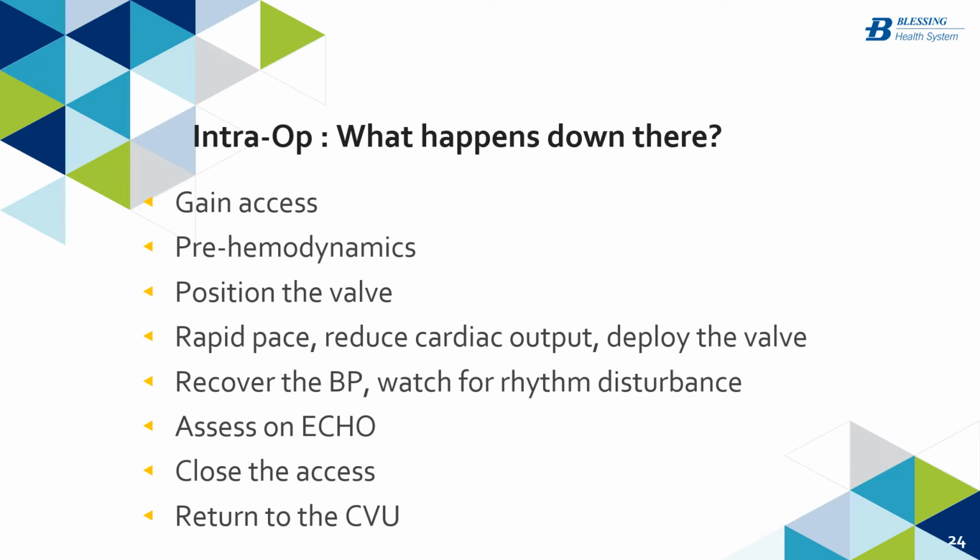The Medtronic valve is a recapturable self-expanding valve. Typically we'll hold on to that one until about 80% deployed, and then we can check with the echocardiogram to make sure that the placement is good, that there's no mitral leaflet impingement, and that all of that looks okay before we finish deploying the valve.